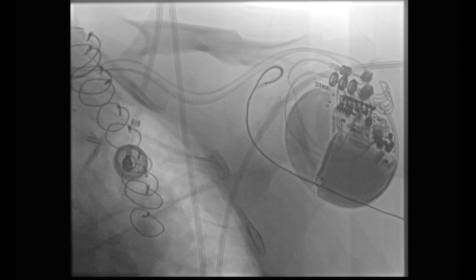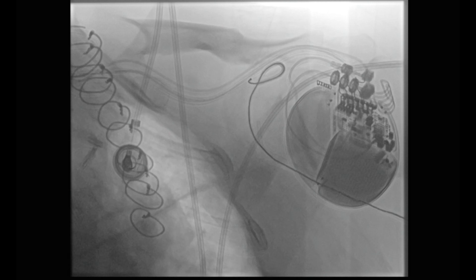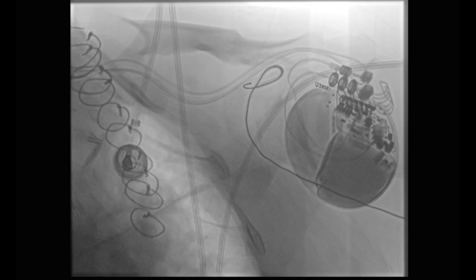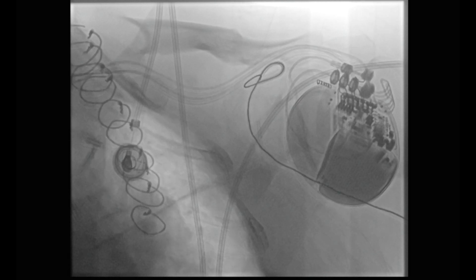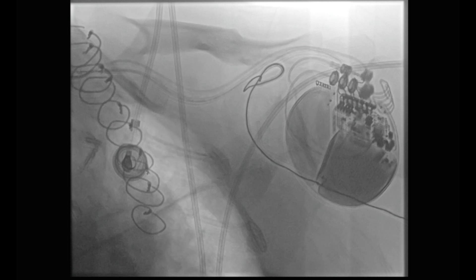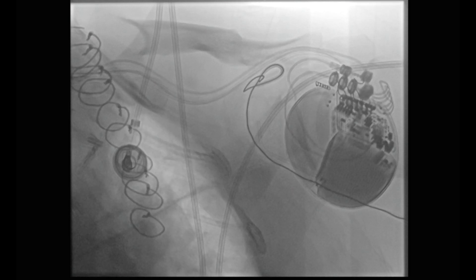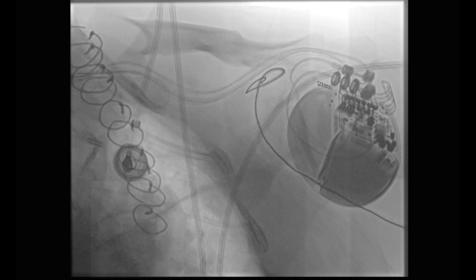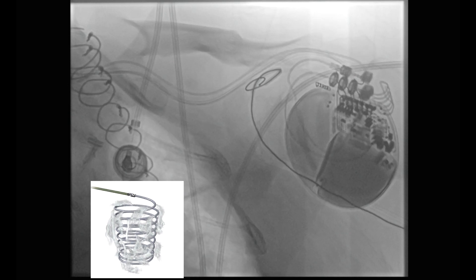A series of 8 and 10 mm helical detachable interlock coils were deployed into the vessel sequentially through the Berne catheter. Caution was taken to avoid coil protrusion or misplacement.